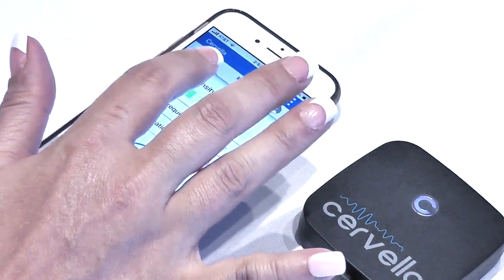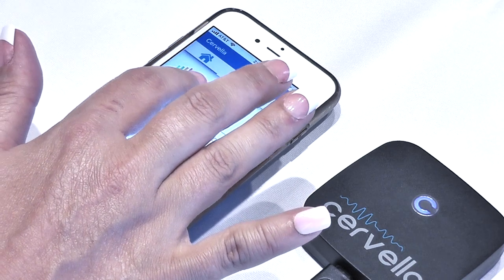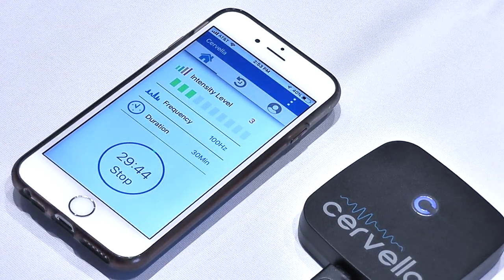Tap the intensity bar up to adjust the current intensity until you start feeling a tingling sensation. Then tap the intensity bar down to reduce the intensity so the tingling sensation is barely noticeable.